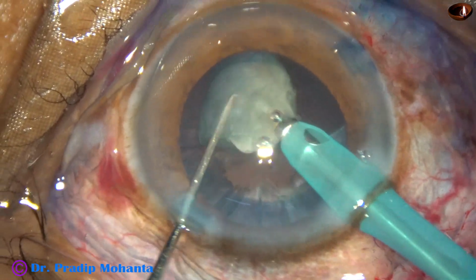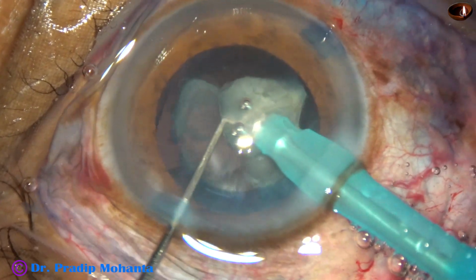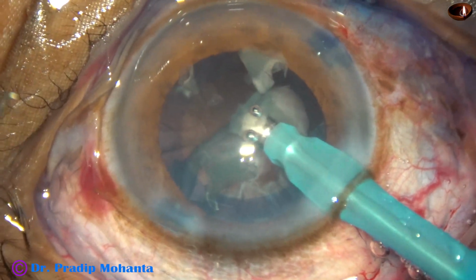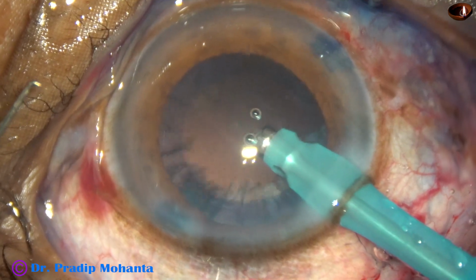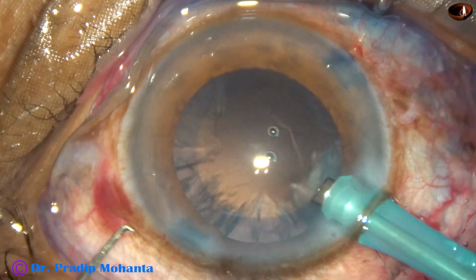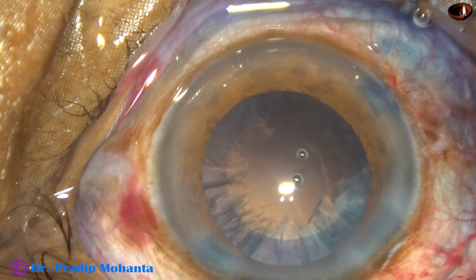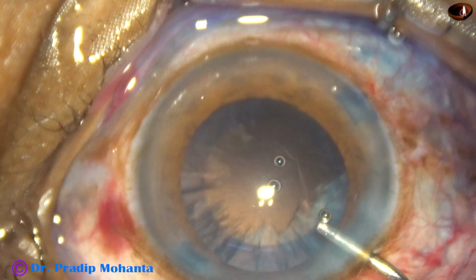At this time we can reduce the vacuum to about 200. With this machine we can remove the chopper for better stability of the anterior chamber, and the emulsification is carried out with low vacuum and low flow rate. And now there is a lot of cortex in this case.